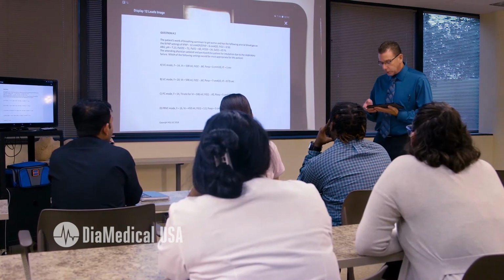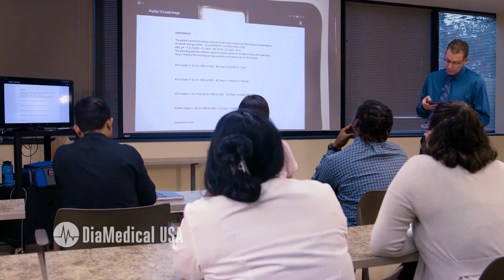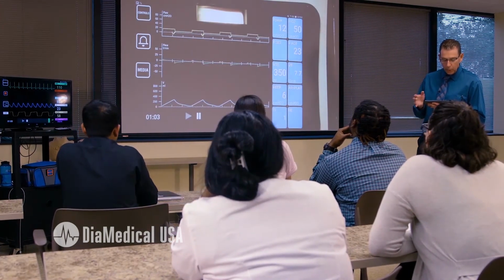You can also use it as a testing scenario. So you can just call up the simulation and then run them through a test, and you can see whether the student grasped the concepts from the education to the testing piece.